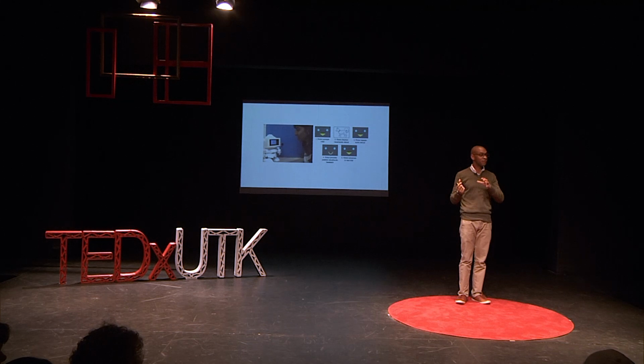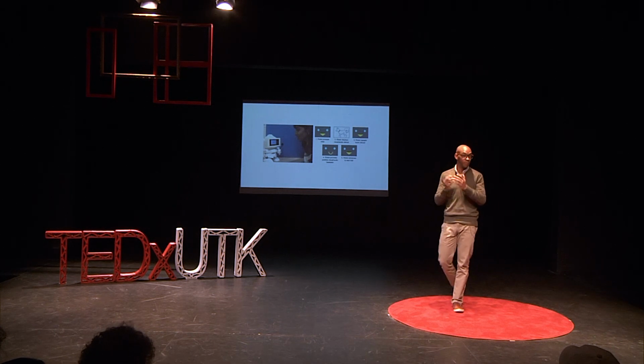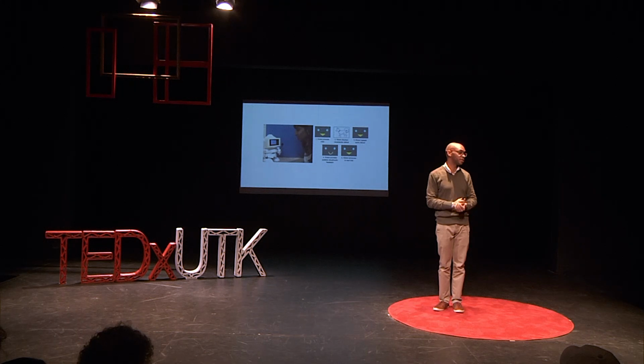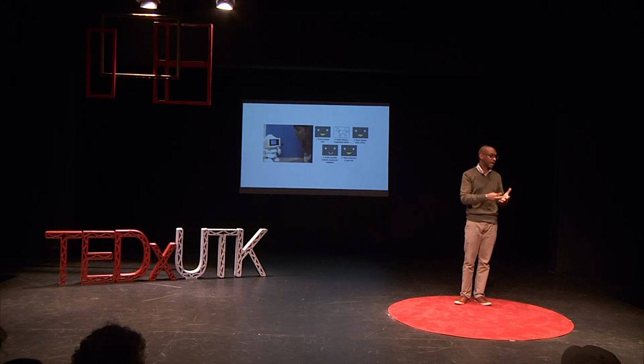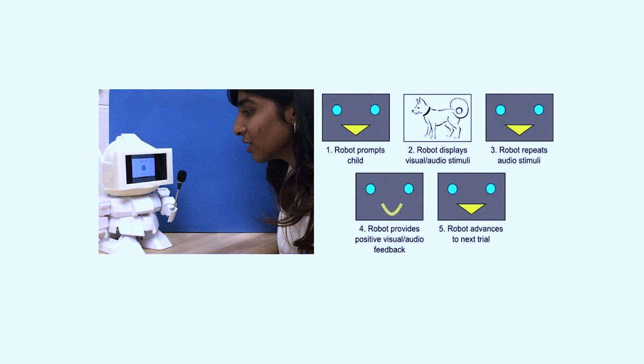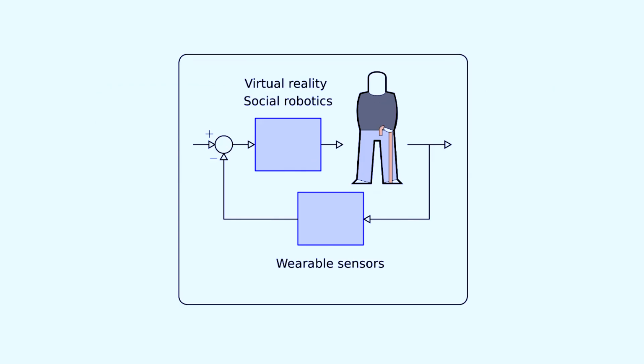But we took the cell phone and programmed that cell phone to provide specific responses to the individual. In other words, the robot speaks to the child, it puts up an image, the child verbalizes, the phone can use voice recognition software that's essentially built into the phone, monitors that information, then provides contingent feedback, okay? So again, the point here is that it's contingent, it relies directly on what the child is doing, and it's based on the underlying theory behind what the speech therapist would be doing normally with the child.